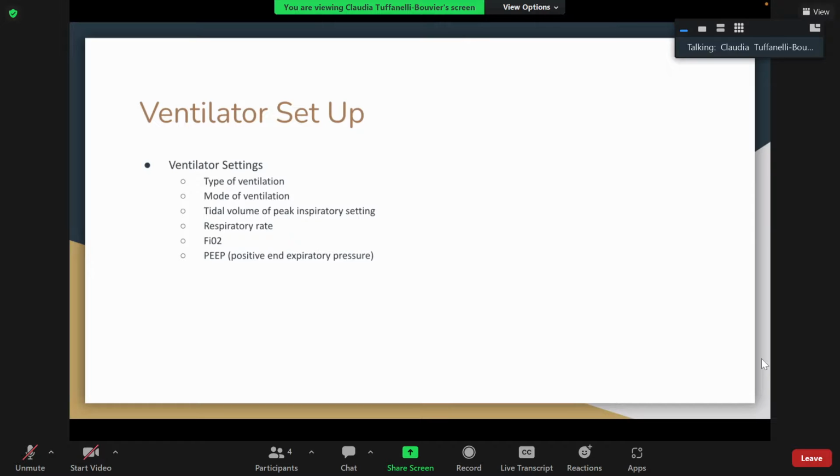Sometimes, for whatever reason, you can't get the patient to the ICU, or you're going to be the most qualified person to set up the ventilator. And in some cases, like with COVID, we saw it, we have people that are intubated that might be stuck in the emergency department for prolonged periods of time. So having an understanding of the ventilator is really important as the ER doctor. A lot of times it's going to be on you to problem solve.